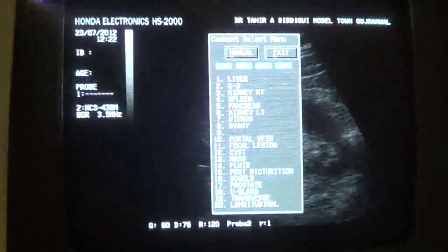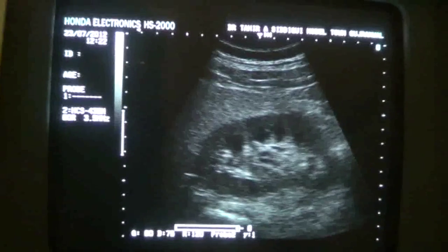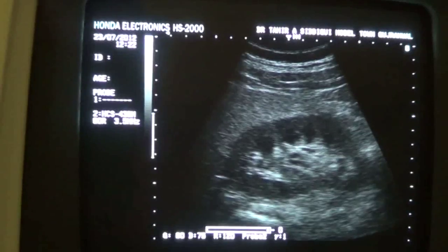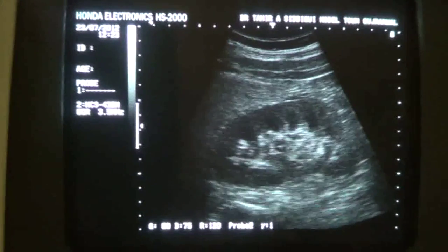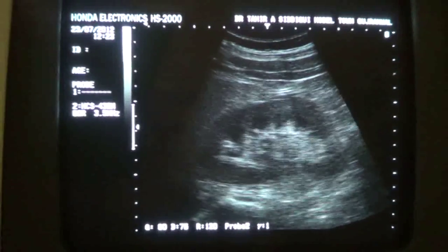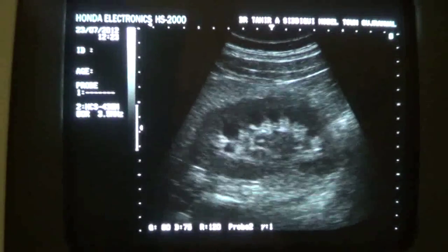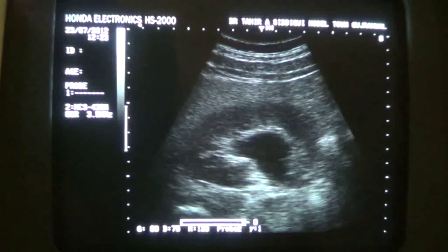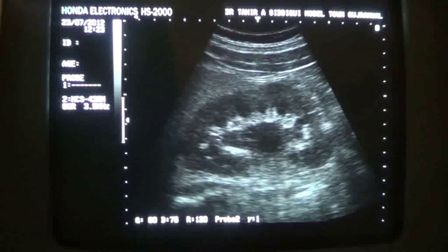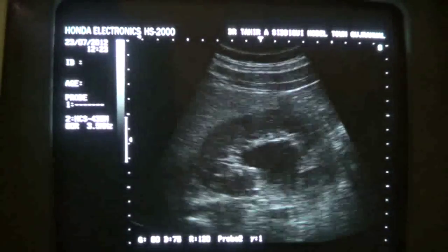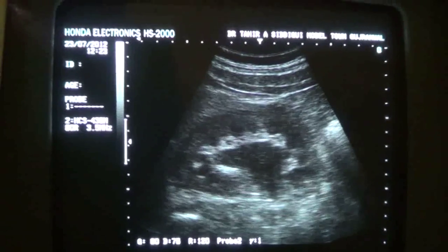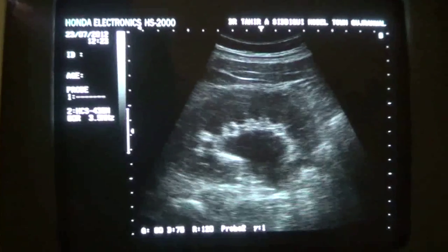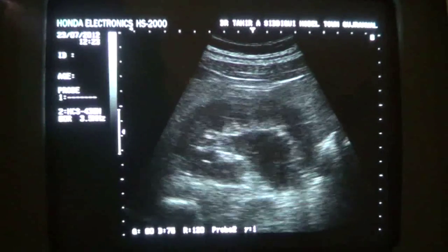Now this is what happens when the examining technique is wrong. You see the prominence of the pyramids throughout, and when I move the probe towards the left side, I see the dilation of all the calyces with echoes in the dilated calyces.